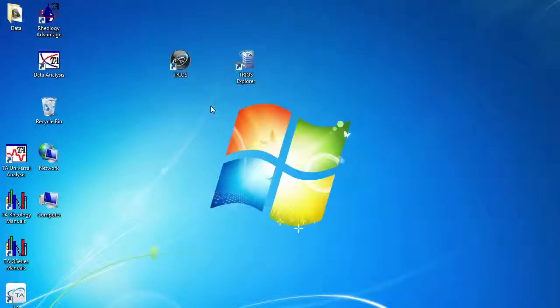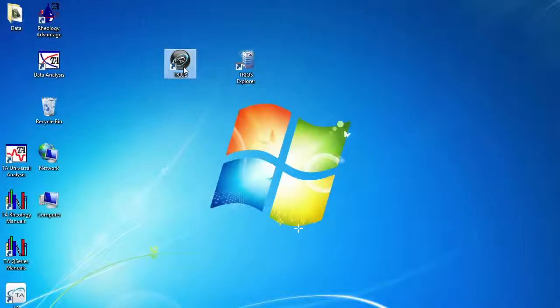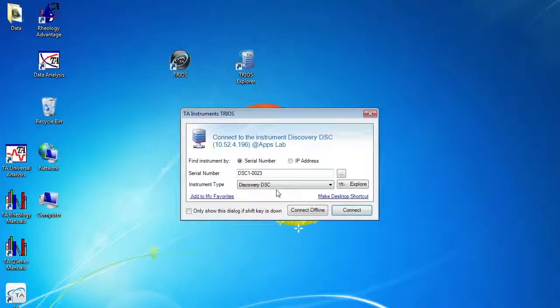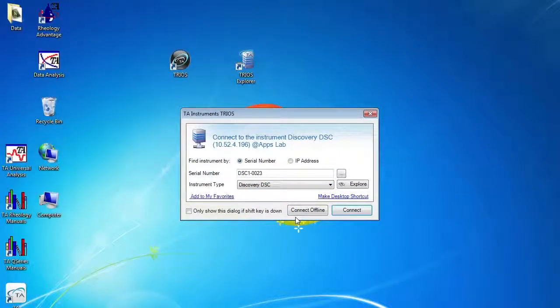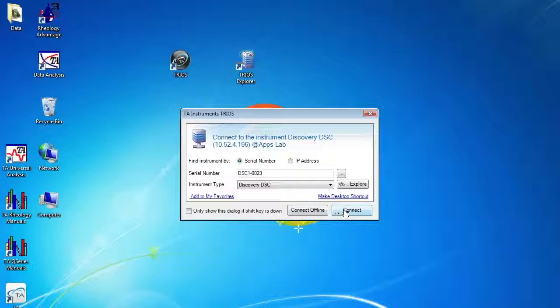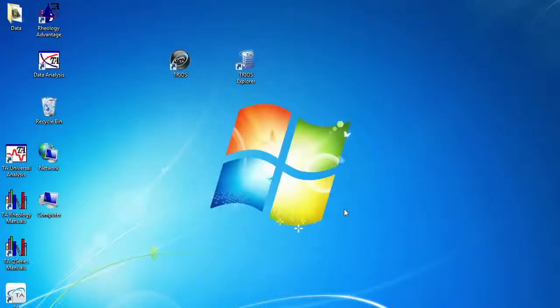To connect to the instrument, you may use either the TRIOS Explorer or the TRIOS Bubble. If you would like to just perform data analysis, you may choose to connect offline. This also allows you to analyze data on a computer that is not connected to the instrument. Otherwise, select Connect.